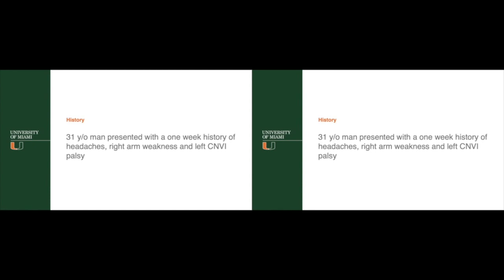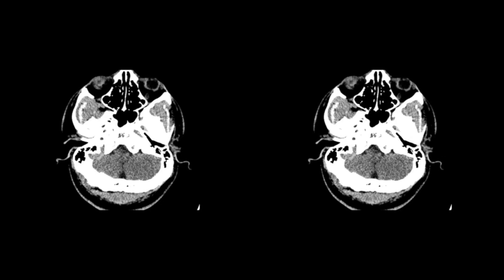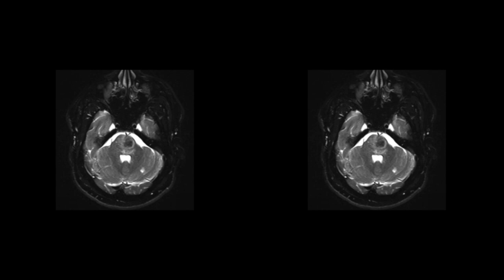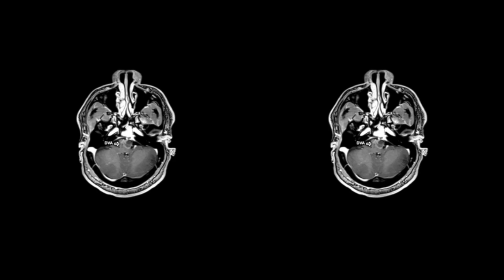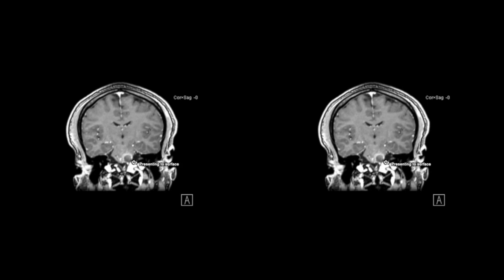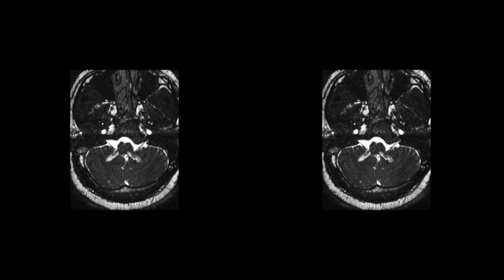The case refers to a 31-year-old man who presented with a one-week history of headaches, right arm weakness, and left cranial nerve 6th palsy. A CT scan revealed a hemorrhagic lesion in the left lower pons, and a T2 MRI showed the classic popcorn appearance of the cavernous malformation. An associated developmental venous anomaly was seen on the contrasted images at the medial border of the lesion. The cavernous malformation presented to the surface of the pons just above the pontomedullary fissure and just superior to the left vertebral artery.